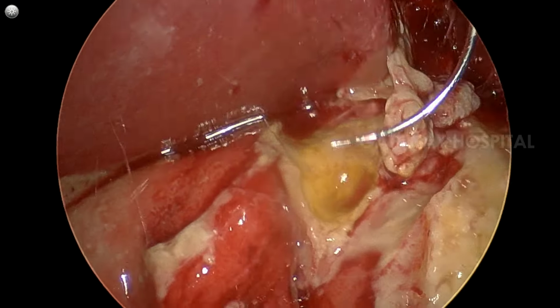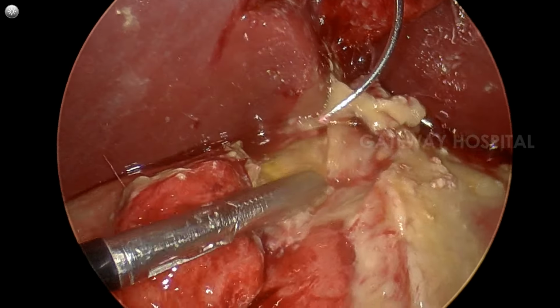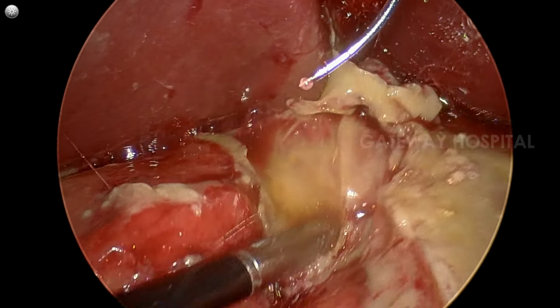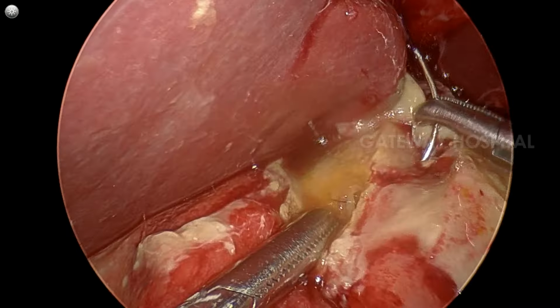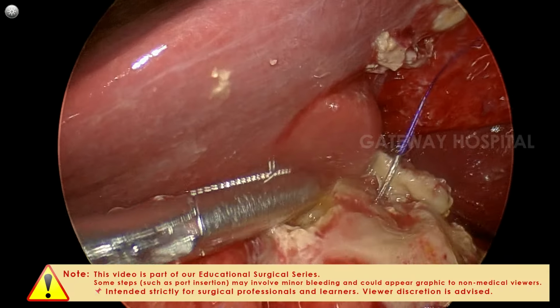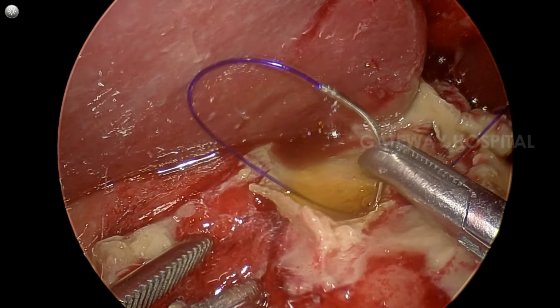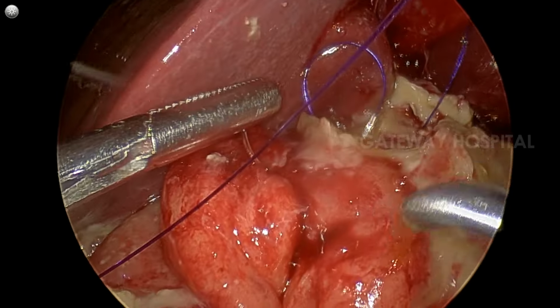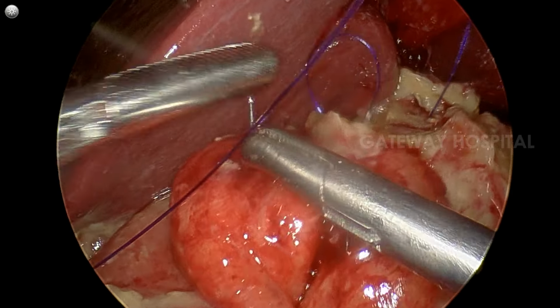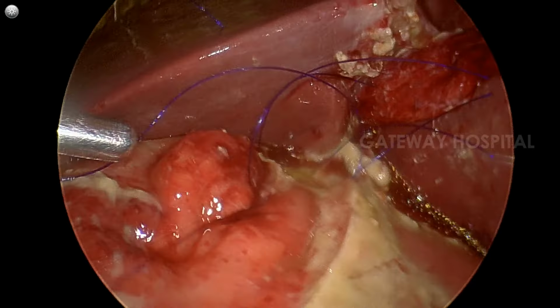That is not needed. And sometimes if it is a delayed perforation, the omentum will be like a mass, and it is difficult to bring the omentum, which is rigid, and place it over the perforation while closing. So this falciform ligament is very useful. And we take 3 sutures normally. We are using a 2-0 PDS suture.